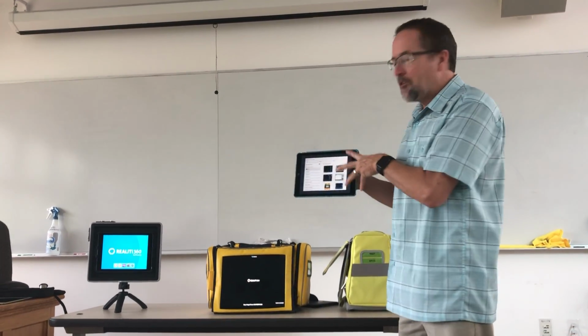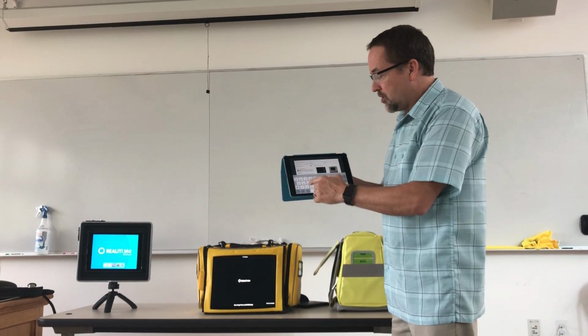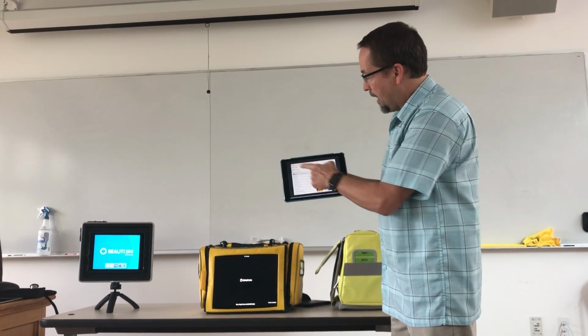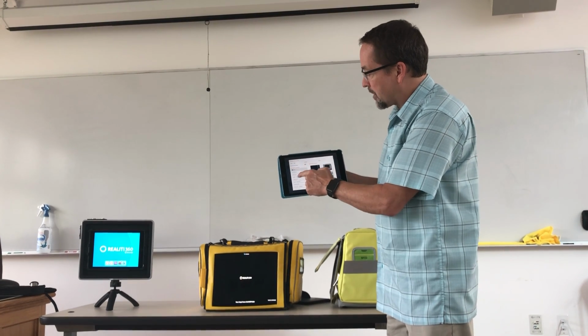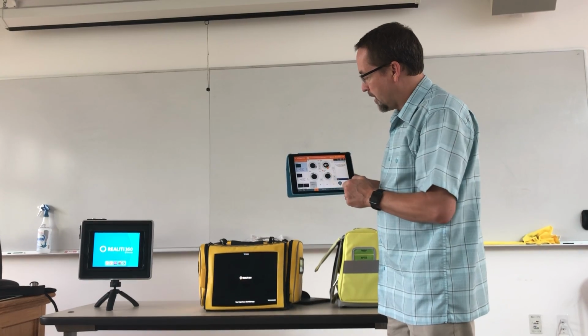Anyway, so from the startup screen, you can enter a student name. You don't have to, but if you're going to do review, if you're going to download video, if you're going to share video with a student, you can capture it here, and I'll just put some initials in there just to do it. So I have a student name, and then I can pick a scenario. So we will, let's see, I'll just pick a demo scenario.